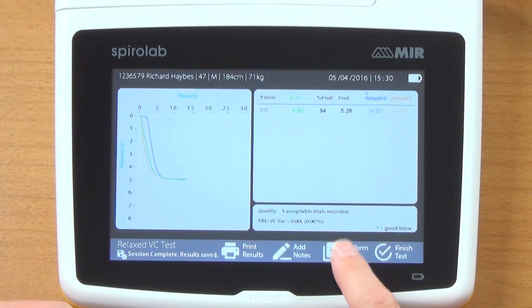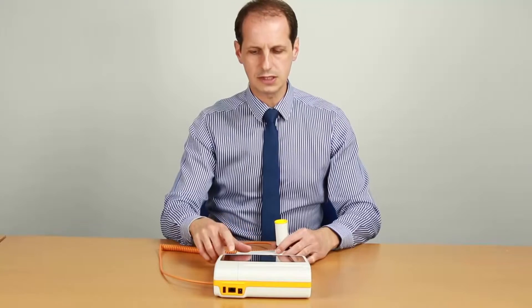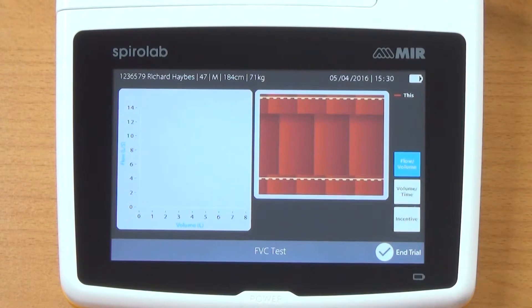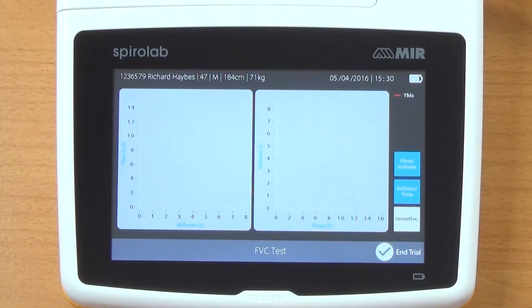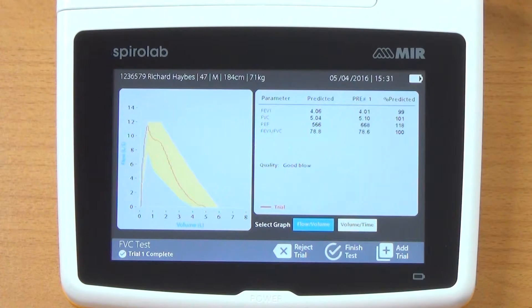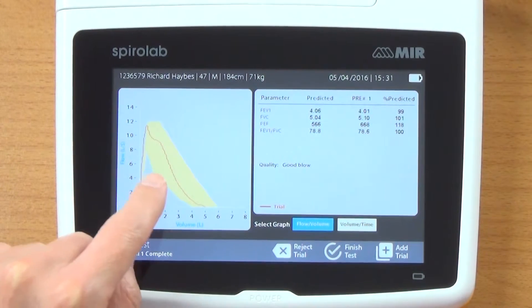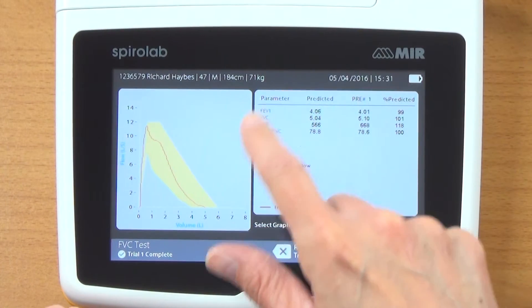I click on the forced vital capacity option. We get the flow volume and volume time graphs on the screen. There is an incentive feature as well — a curtain which moves across and exposes the picture behind — but I'm just going to use the graphs. So I've done my first test, and you can see it has a shaded area, which is the predicted area based on my details. My graph is obviously in between that.